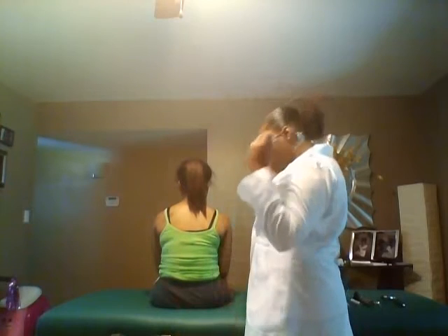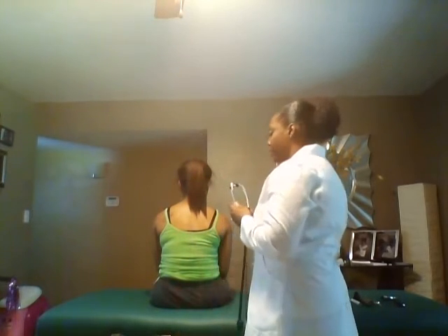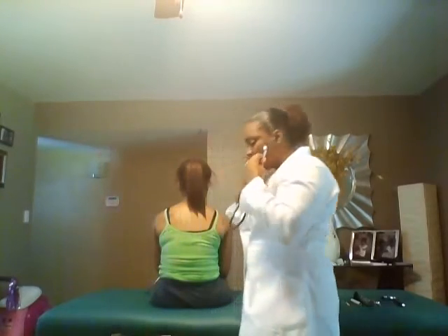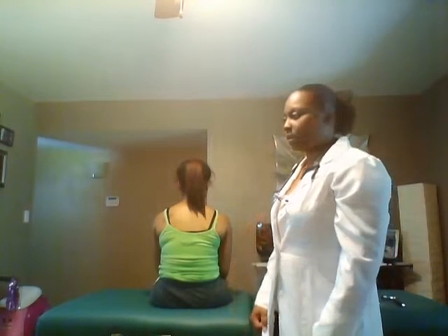And now I will also listen to her lungs. And as the stethoscope hits your back, if you just take a deep breath. And laterally. And she has normal rate and rhythm, no crackles or wheezing heard.